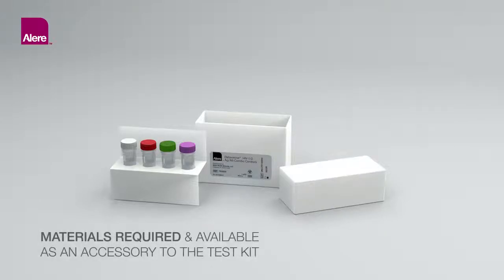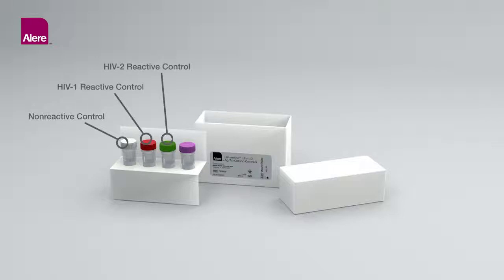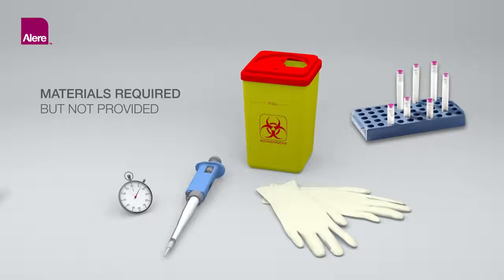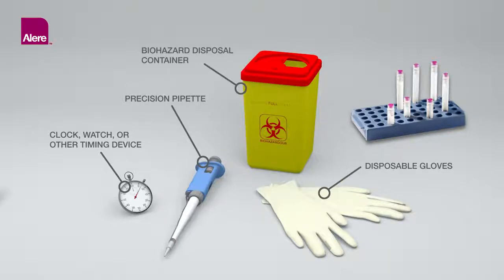Materials Required and Available as an Accessory to the Test Kit: ALIR Determine HIV-1-2 Antigen-Antibody Combo Controls. Each Kit Control Box contains 4 vials: 1 Non-Reactive Control, 1 HIV-1 Reactive Control, 1 HIV-2 Reactive Control, and 1 HIV-1 P24 Antigen Control. Materials Required but Not Provided include a clock, watch or other timing device, precision pipette capable of delivering 50 microliters of sample with disposable tips, disposable gloves, biohazard disposable container, and collection devices for specimens other than finger stick whole blood specimens.